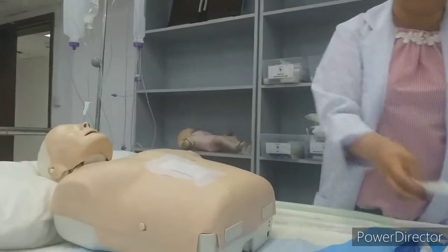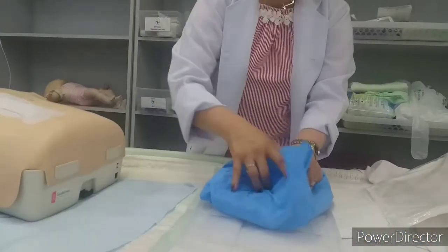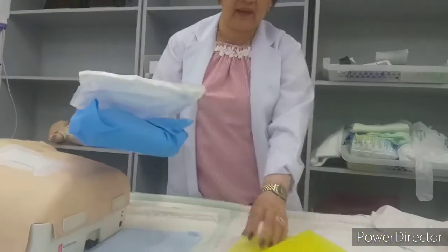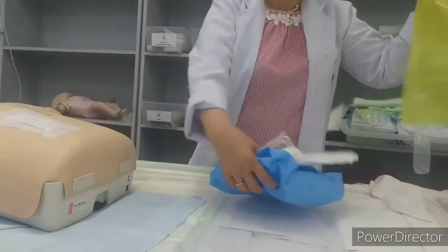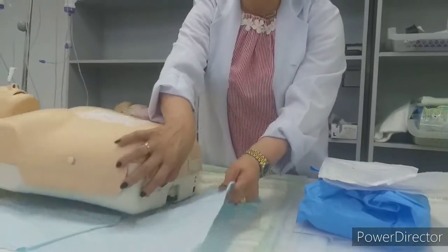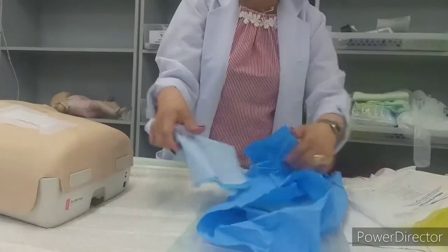Okay, all of this gather together. So once we are done, take off the dressing pad together inside of this.